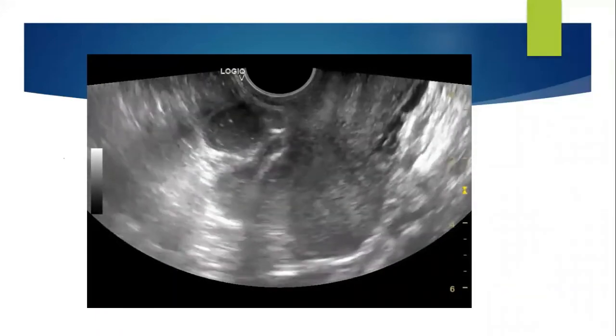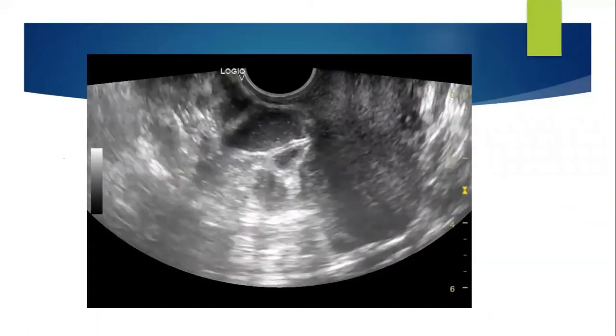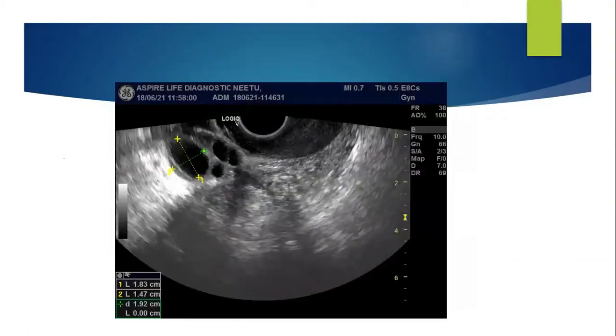So this axial position of the uterus is also extremely important, and sometimes on transabdominal scan you're not able to identify the endometrium very nicely, and we have to go for a transvaginal scan to identify this. Again, see this. I am always holding the probe correctly. So no matter what difficult situation I fall into, I keep the urinary bladder on one side, that is the right side. This was the right ovary, and see again, the uterus is almost turning away.